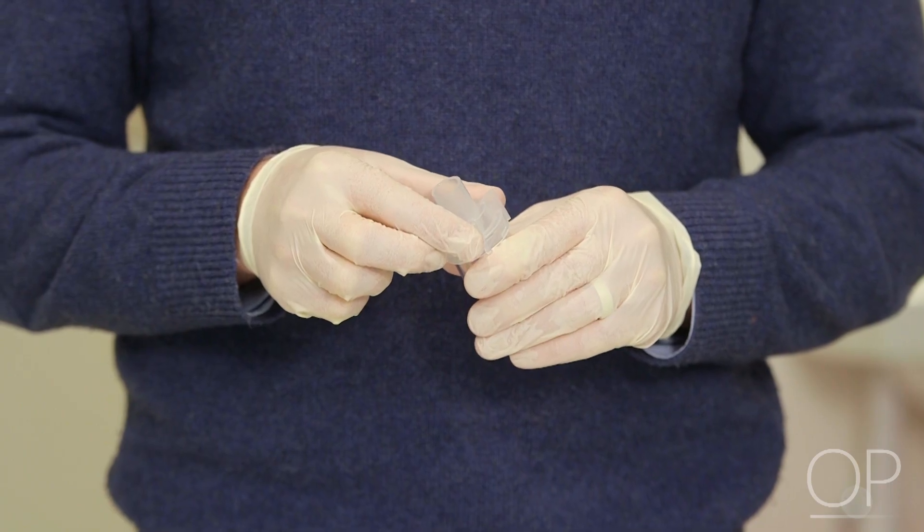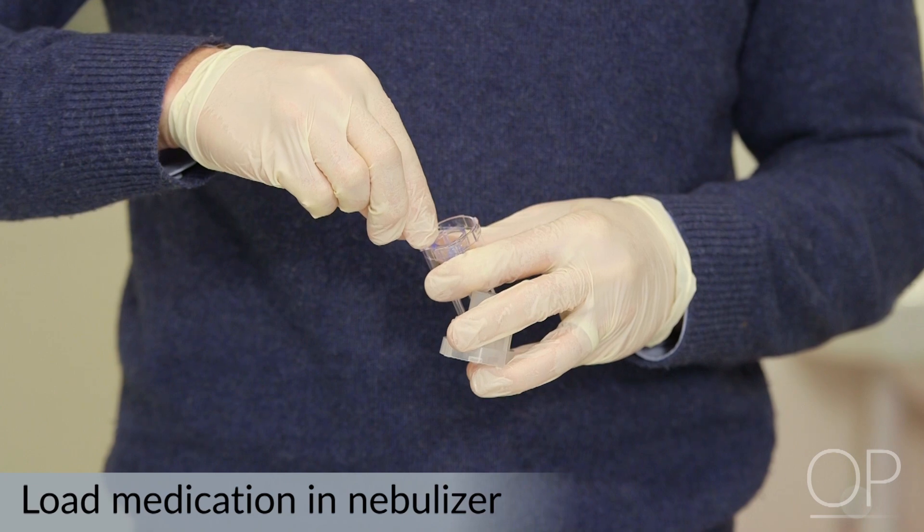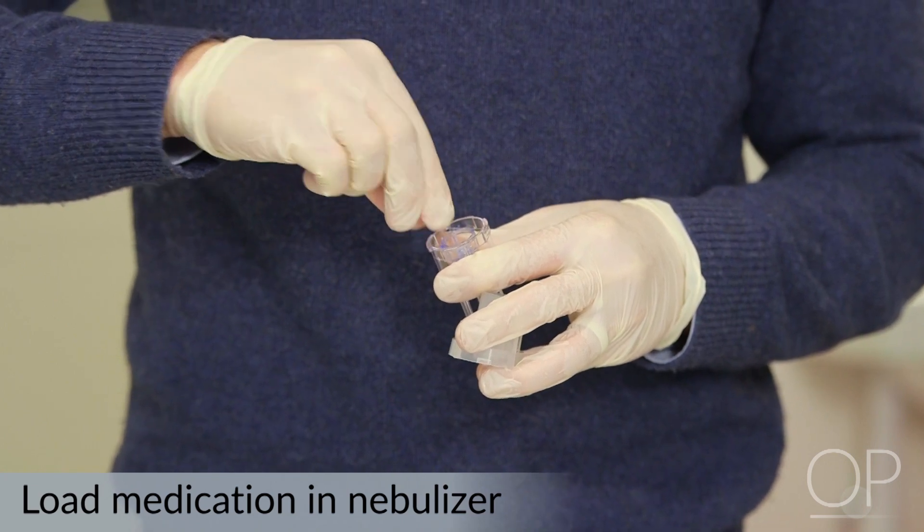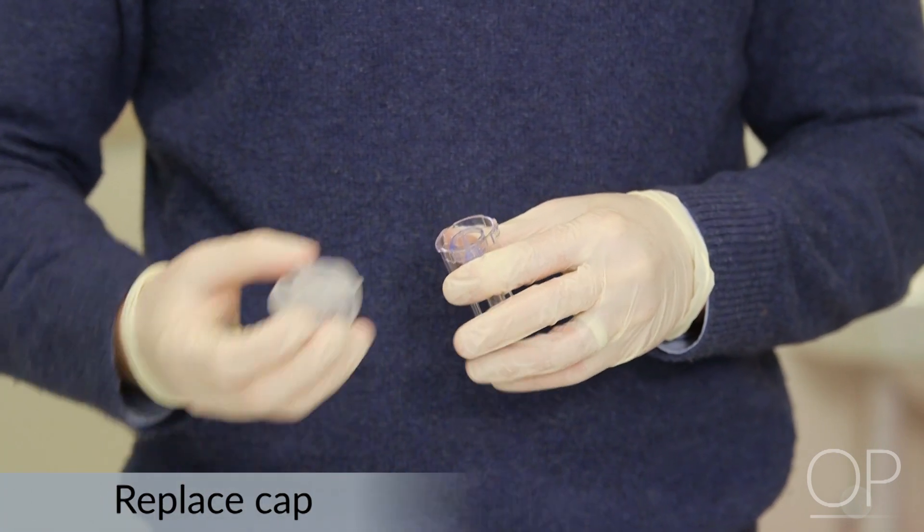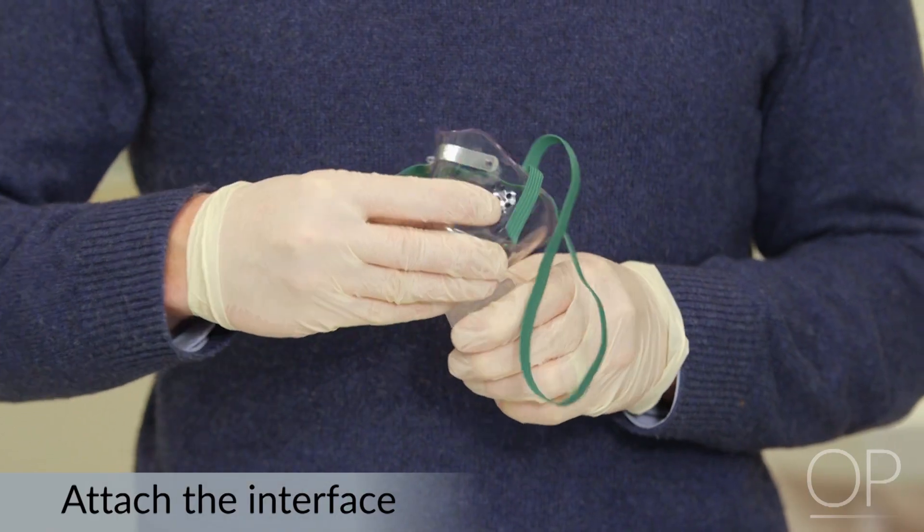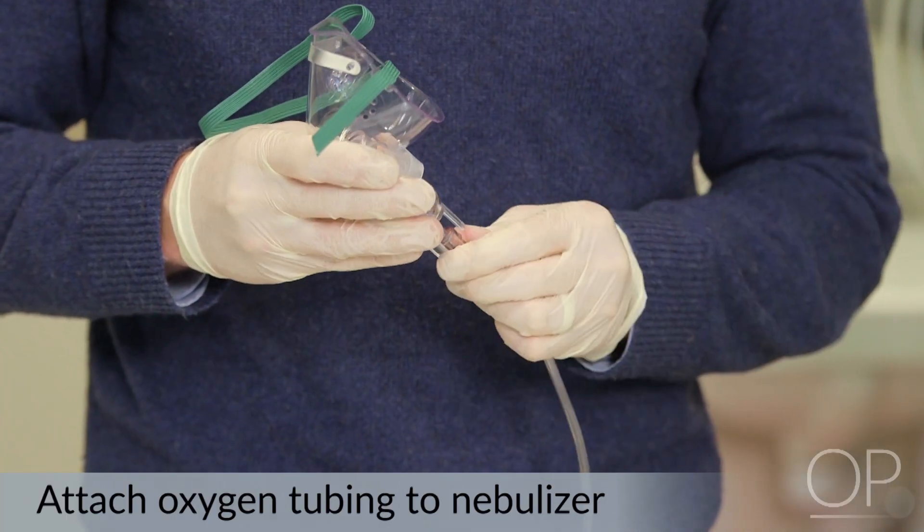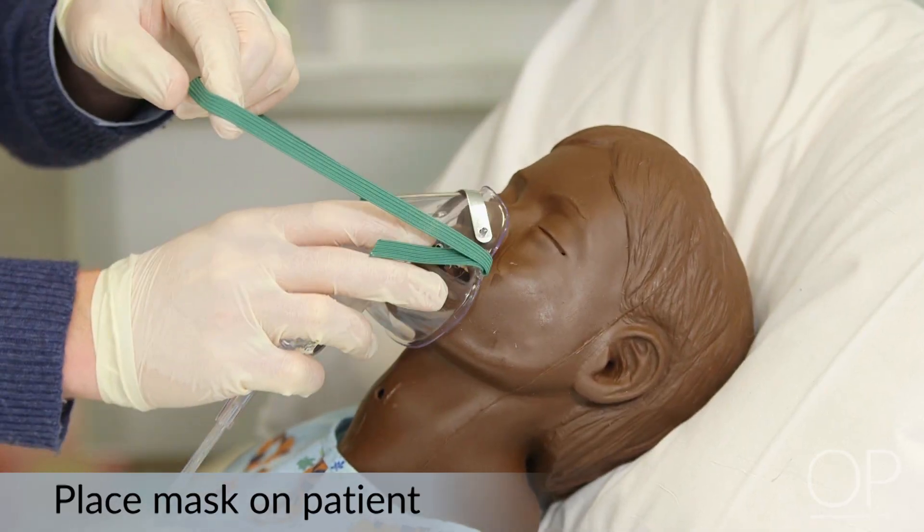Next, I have our drug. I've removed the cap and I'm going to take our medication, which is in a liquid suspension, and place it inside the device. We're going to replace the cap, attach the interface, affix the oxygen tubing to the bottom portion of the nebulizer, and place the mask on our patient.